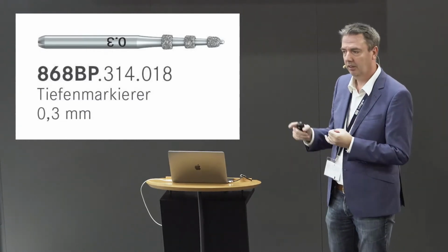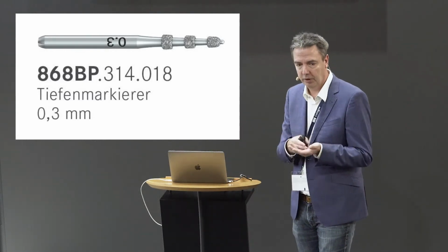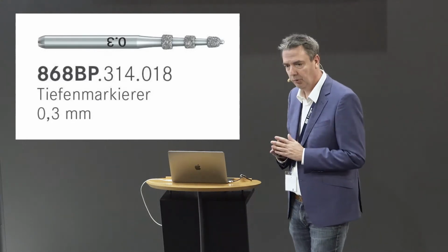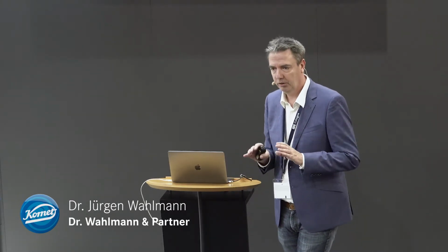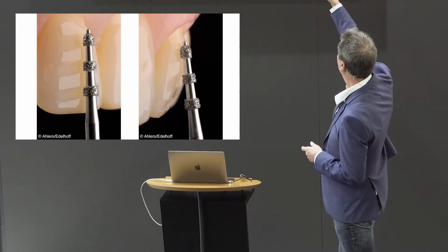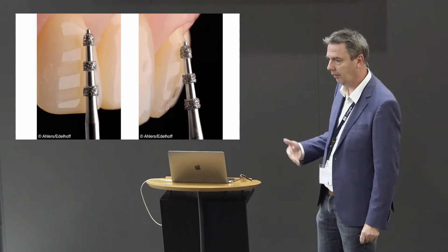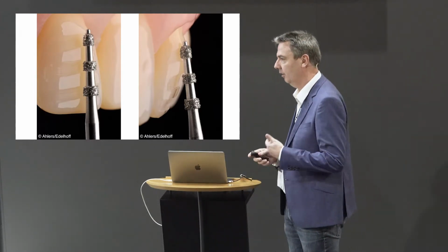And this means from now on, I always recommend, instead of using the 1 ring burr, this one, because with this one, it's not possible to do it wrong. Even if you're a beginner, if you have absolutely no experience with veneer preparations, you will never make a mistake. This is 100% safe. You can see this in the next picture. You see here, it's not possible to go too deep into the tooth structure. And that's ideal. It's really a breakthrough.